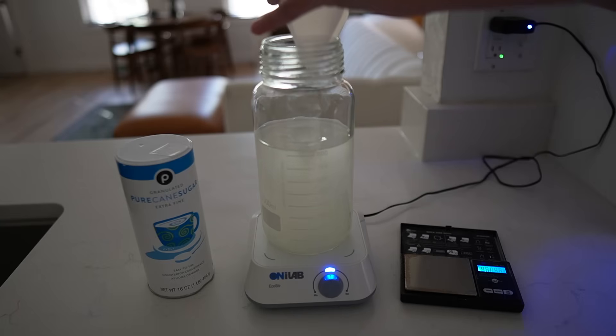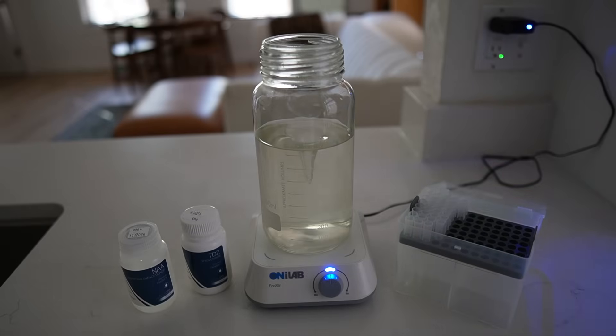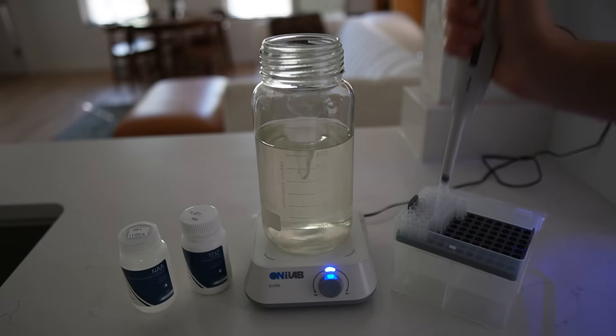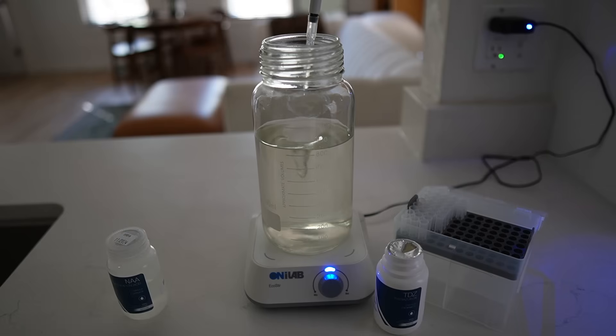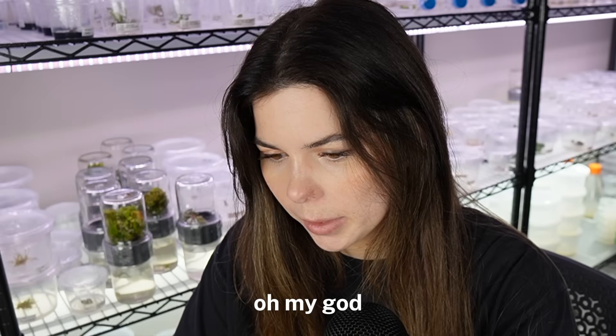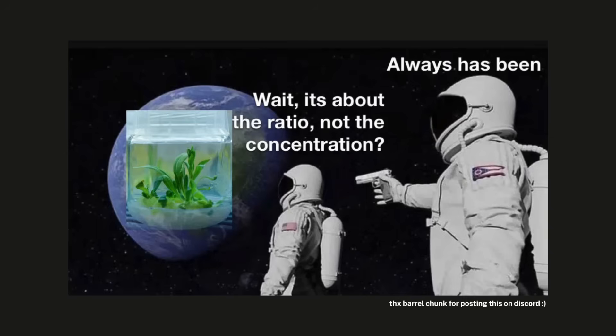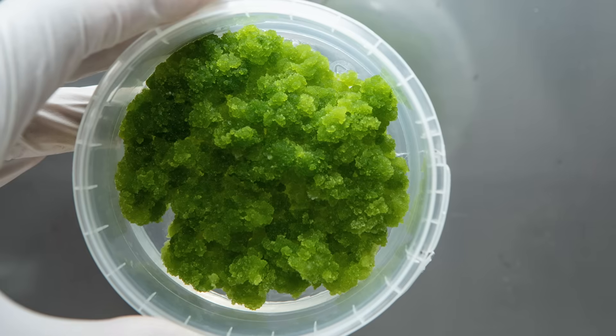This media is going to be for my anthuriums and my corpse flowers. I want this media to promote callus formation, so today I'm going to use one milligram per liter of TDZ and one milligram per liter of NAA — both plant growth regulators. TDZ is a cytokinin. Basically, cytokinins promote shoot formation and auxins promote root formation. A high cytokinin-to-auxin ratio gives shoots, more auxins gives roots, but using them in an equal ratio produces callus. Callus is a mass of undifferentiated cells.